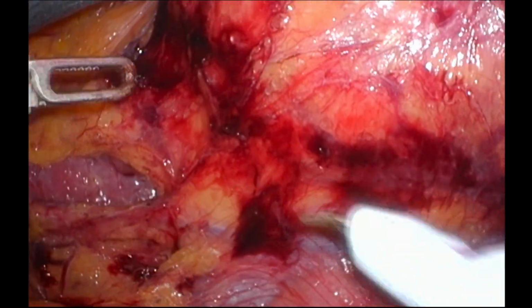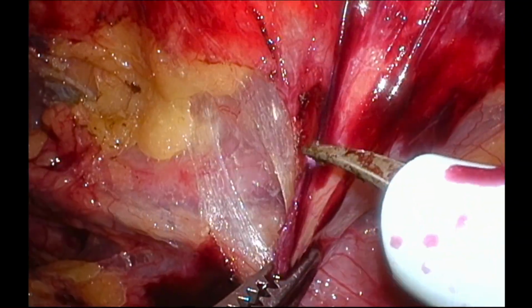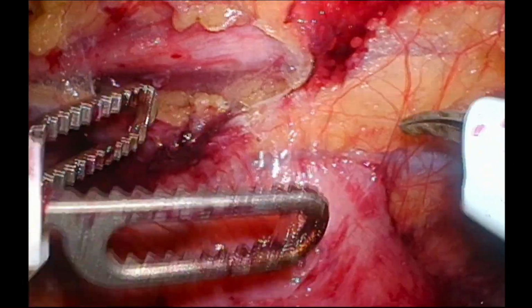As the large kidney tumor was falling medially, we use the retraction arm to retract the kidney mass superolaterally. Dissection is proceeded cranially towards the renal hilum.